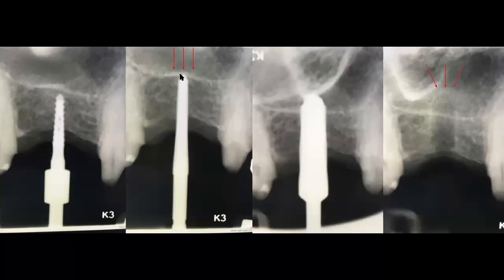So with this drill, I'm now going to go all the way to the floor of the sinus, being careful that I don't penetrate or perforate the sinus. For this, obviously, you do have to be very careful because we just have this little thin wall there, but you will feel when the drill is actually touching that cortical plate on the sinus floor. And once you do that, then I'm going to start using all the Versa drills in reverse.